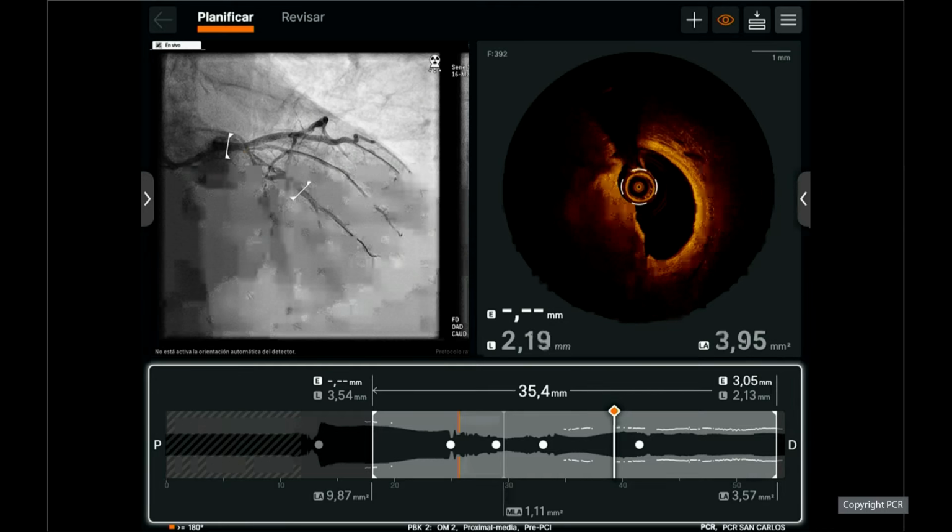You see more disruption. And I was mentioning before, you can see that the nodule is now protruding even more into the lumen because it's disconnected, let's say, from the shoulder. So sometimes they protrude even more after modifying them. And here we're back in the left main with the images we saw before. So really, I think we have achieved quite a good degree of modification of this nodule.